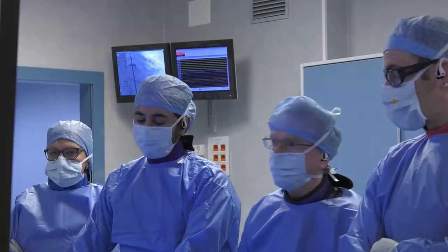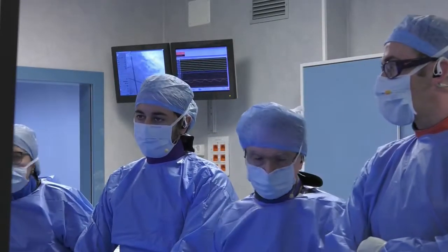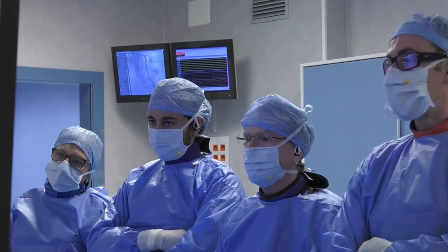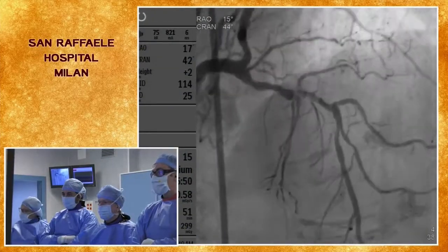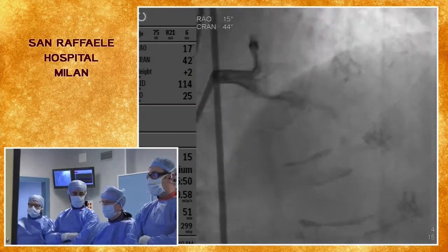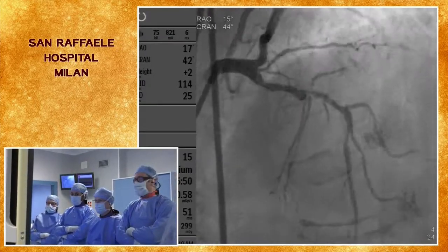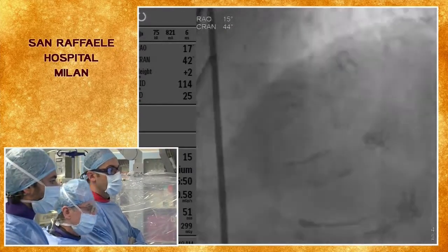Okay. So the lesion in the LAD is definitely calcific. So our strategy is really, you see, there is a chunk of calcium. I think if you think rota ablation, you have to do rota ablation. We're going to do rota ablation. It's a long disease, starting from the very proximal. The ostium, I think, in this view is okay, and goes right after the second diagonal.